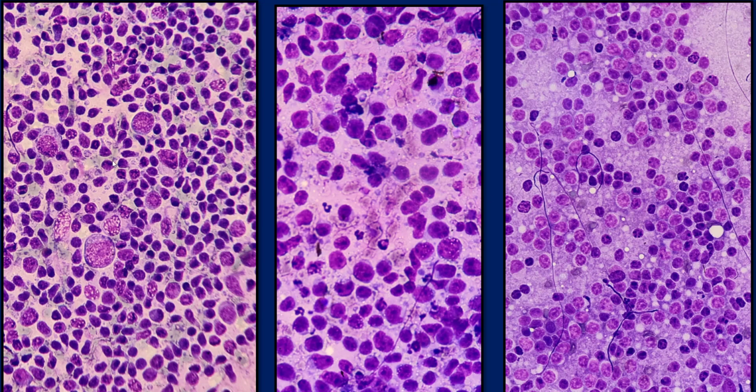Here we see pretty clear-cut evidence of a polymorphous population of lymphoid cells, from small lymphocytes right up to immunoblasts. In such a case, we might think that we are possibly dealing with a reactive lymph node, and most of the time you're going to be right. In this case, you have a rather monomorphous population of large lymphoid cells. So you feel we are dealing with non-Hodgkin's lymphoma, possibly going to turn out to be a diffuse large B-cell lymphoma.